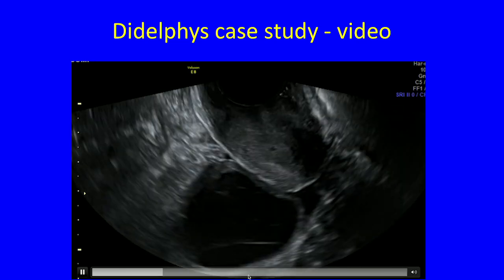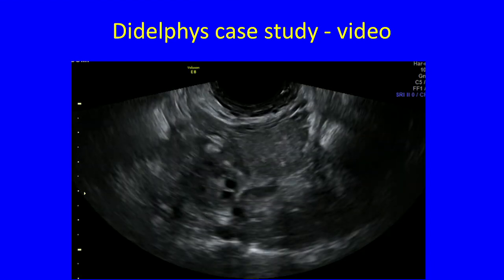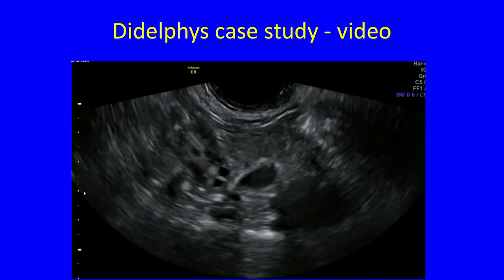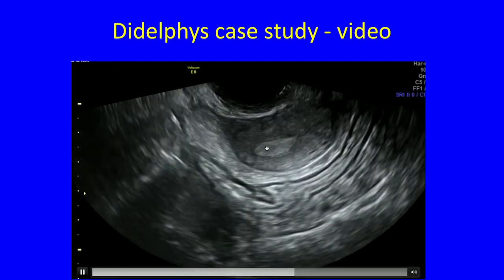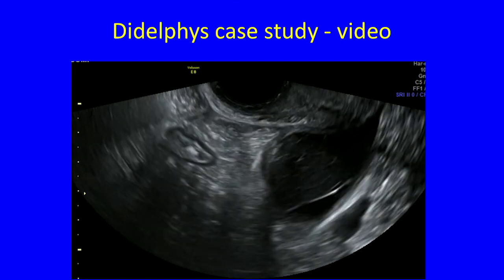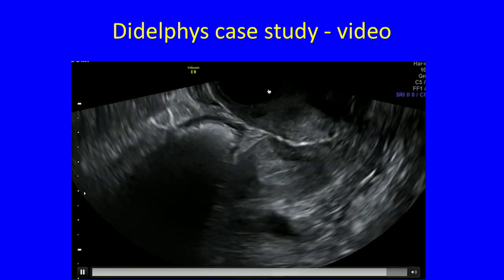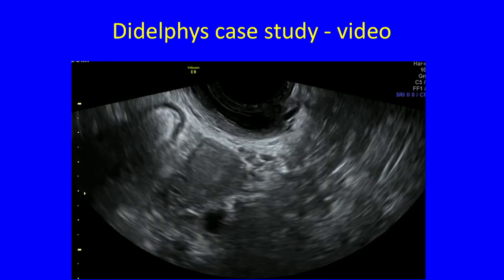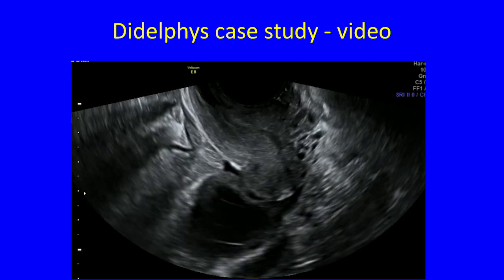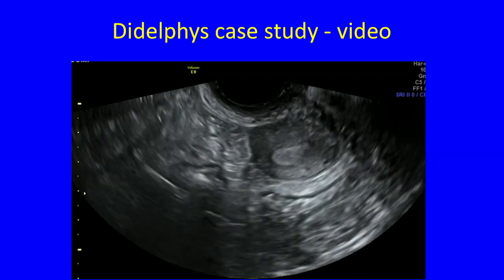What you've seen probably by now is there's a little hemorrhagic ovarian follicle cyst, so she has ovulated. You can see that there are two uterine bodies. Let's wait for one to come in with luteal phase endometrium. Again, evidence she has ovulated. There's one. There's that hemorrhagic follicle going out the other side. You can't get very good views of the cervix, and that's the only problem with this little video clip. One uterine body and another one, and there seems to be some fluid just at the top there.